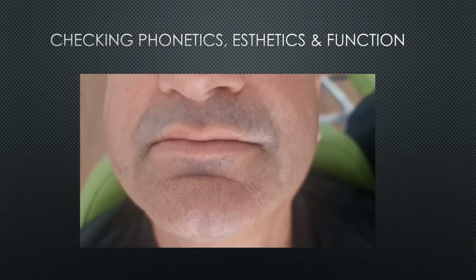So now here, the follow-up after 1 week, I told the patient to come and we altered his vertical dimension. We want to make assessment for his voice and function, and hear the patient talk. Okay, let's listen.